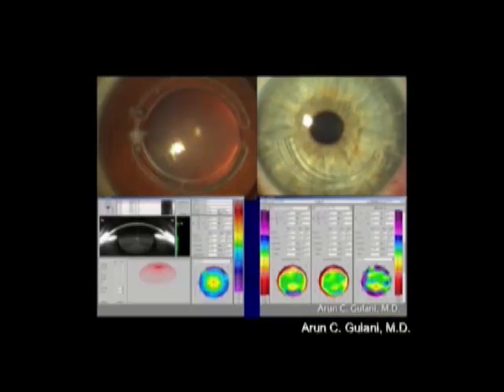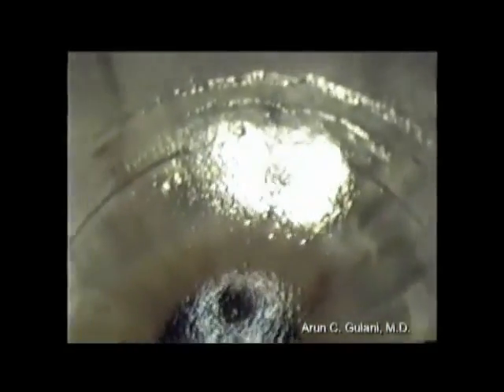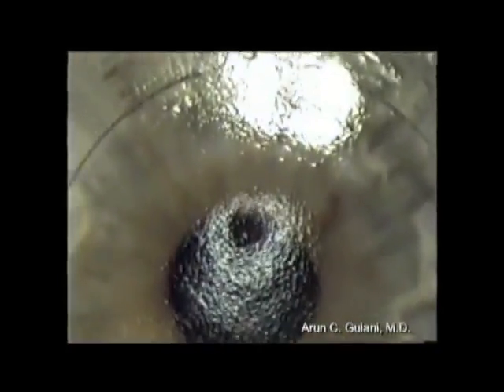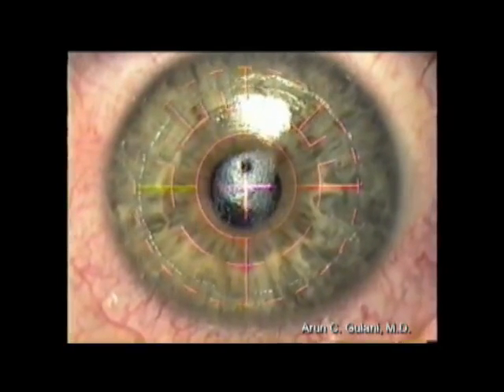Once the Intacs rings are in place, we can still enhance the vision by glasses, contact lenses, and even laser vision surgery. Surface ablation techniques with the excimer laser can be used, like in this case with a single Intacs ring. This is a high-magnification picture and we are planning an excimer laser refractive correction for the residual astigmatism on this patient who already has an Intacs in place, targeting an emetropic outcome.